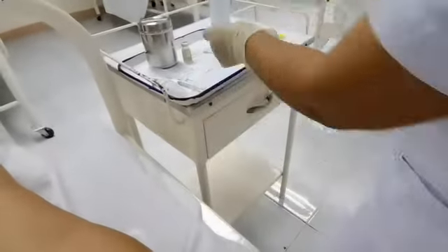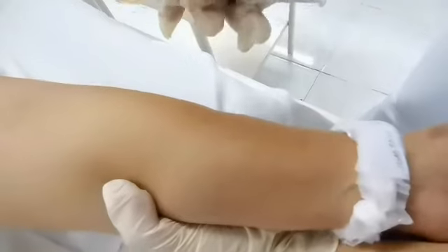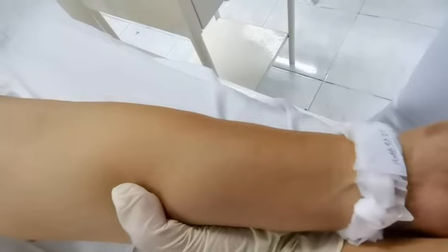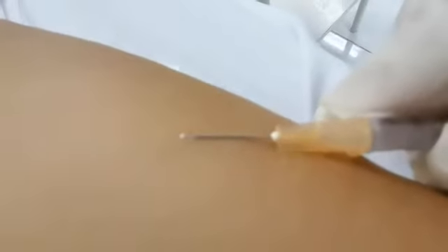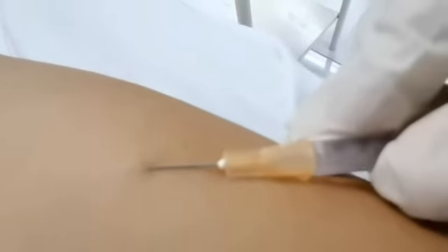Place non-dominant thumb about 1 inch below insertion site and pull skin down. Talk to client and warn on impending needle stick. Ma'am, I'm going to inject the medication, okay? With bevel up and using dominant hand, insert needle just below the skin at 10 to 15 degree angle. Once entry into skin surface is made, advance needle another 1/8 inch. Inject drug slowly and smoothly while observing for blebs.